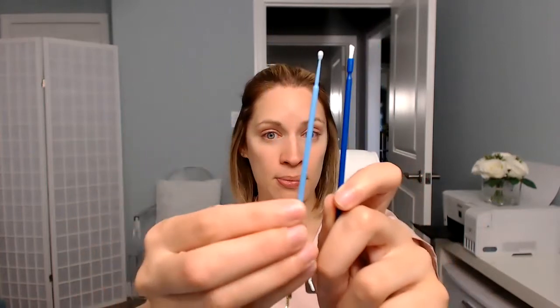What you need is a micro brush - I'm going to show you two different types. You do not want the big one; you want the smaller one. I would use the large one for fluoride varnish. The smaller one is for silver diamine fluoride because it's more concentrated. The bigger brush would get silver diamine fluoride everywhere - it needs to be very concentrated and localized to that area.